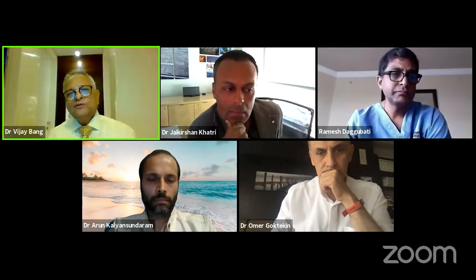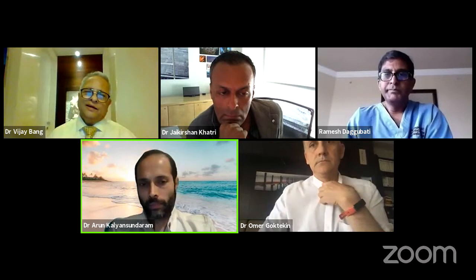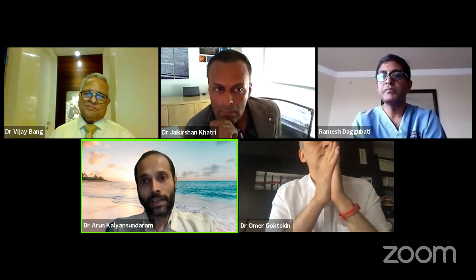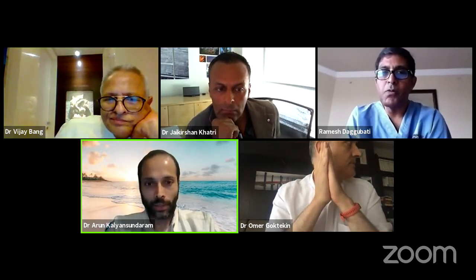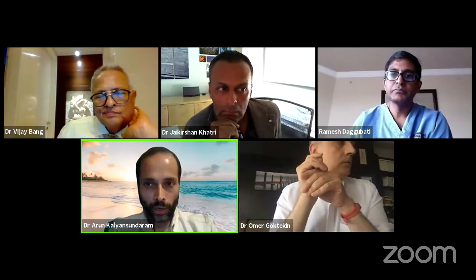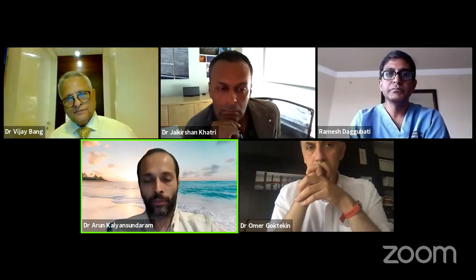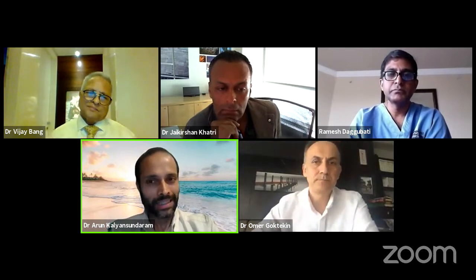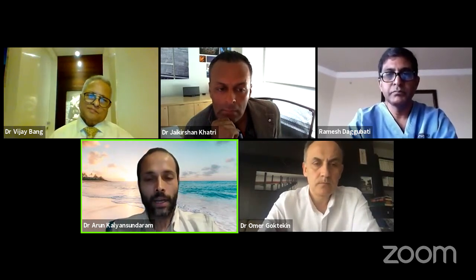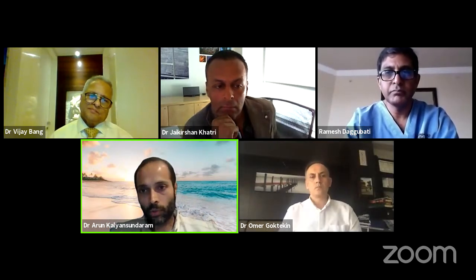Okay. Arun, any comments about this question? Well, I would completely agree with Jay. In general, there are lots of times when I wished I had an Impella or something to help me out, but in a lot of places that I've gone to for proctoring, I don't have it. You get especially worried if you have, let's say, impaired EF, LVEDP is high, and if you're going to have to go retrograde and you're going to cause a lot of ischemia. So there are times when I've actually backed off because the patient doesn't like it, and you can tell. Unfortunately, in some countries, they just didn't have Impella, like when I was proctoring, and you don't have an option.